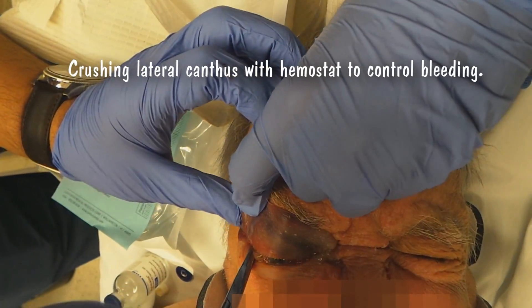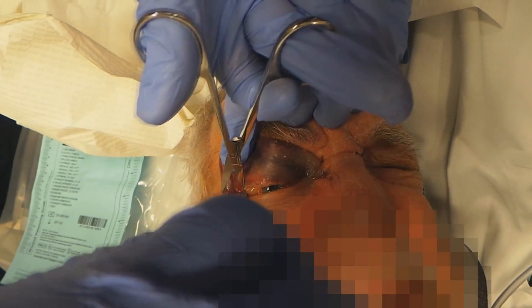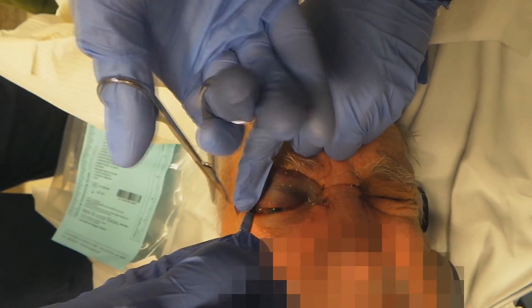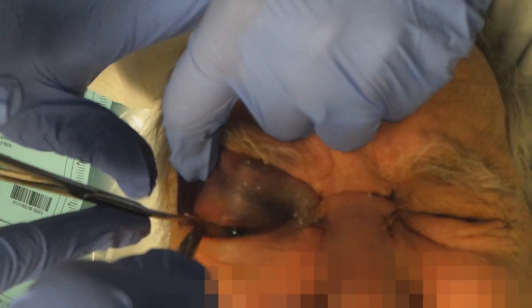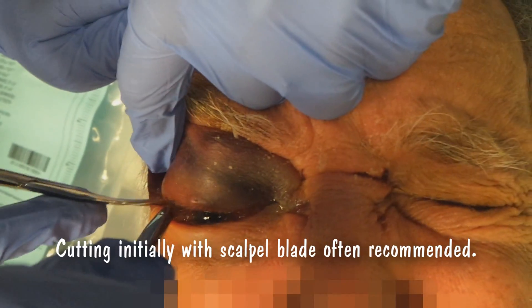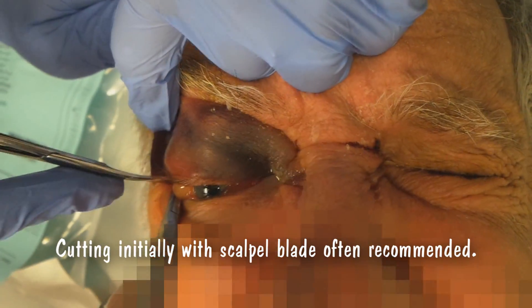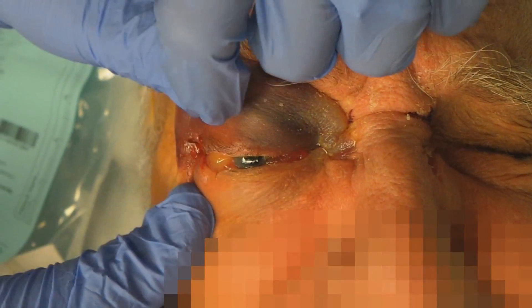Watch the pressure. That's all. Now we'll go ahead and trim. I'm sorry, I know that hurt. I'm sorry, partner. We're almost done. Take it out. Okay, that was 10 minutes there.